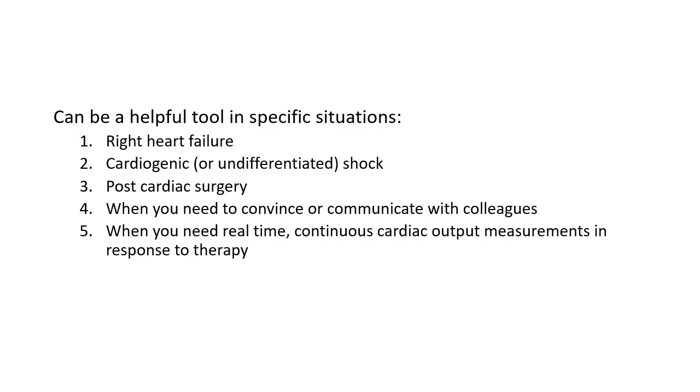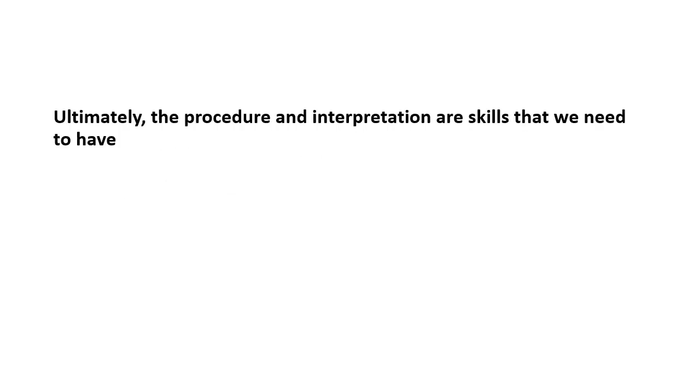So I think this one's important. You know, echo and other techniques are great, and some of them are there where you can get continuous cardiac output measurements, but I think echo and some others may be more time intensive. So just think about that. If you need a real-time readout and you don't want to have to keep going back in the room, which we all are constrained with time, then this may be a good option for you.